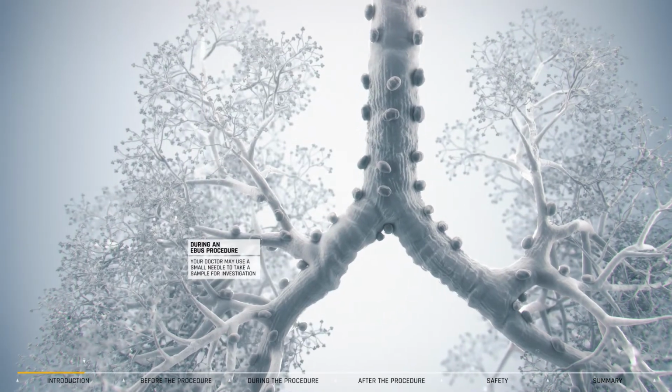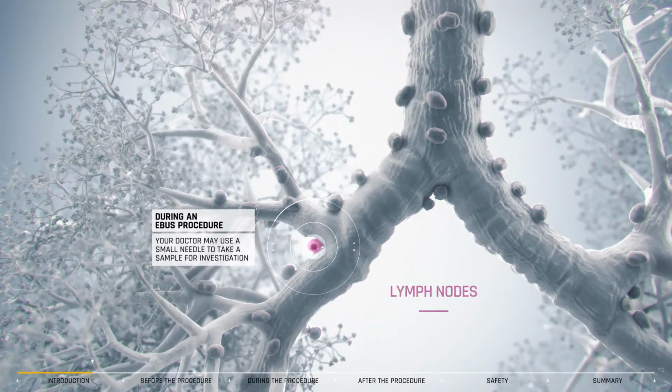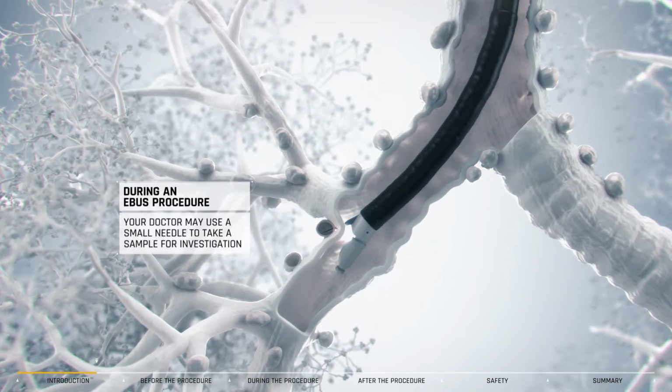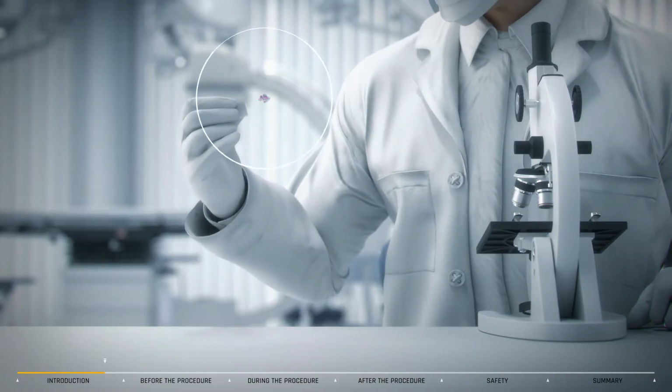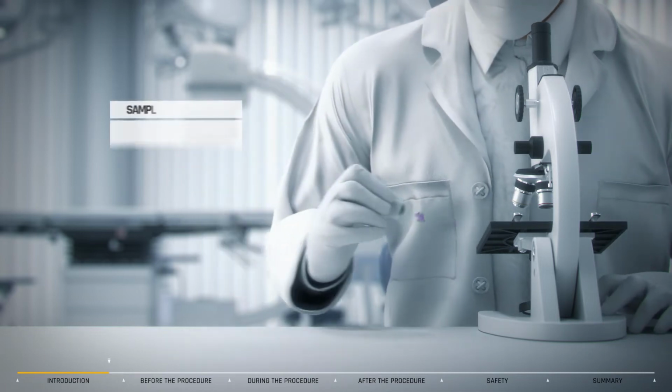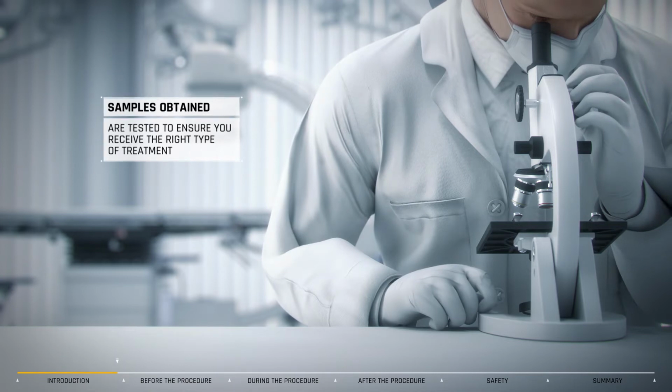During this procedure, samples from parts of lung or lymph nodes that require investigation can be taken with a small needle, which is guided by the ultrasound scanner. The samples obtained are tested in the laboratory to diagnose diseases. This is an important process for you and will ensure that you receive the right type of treatment.